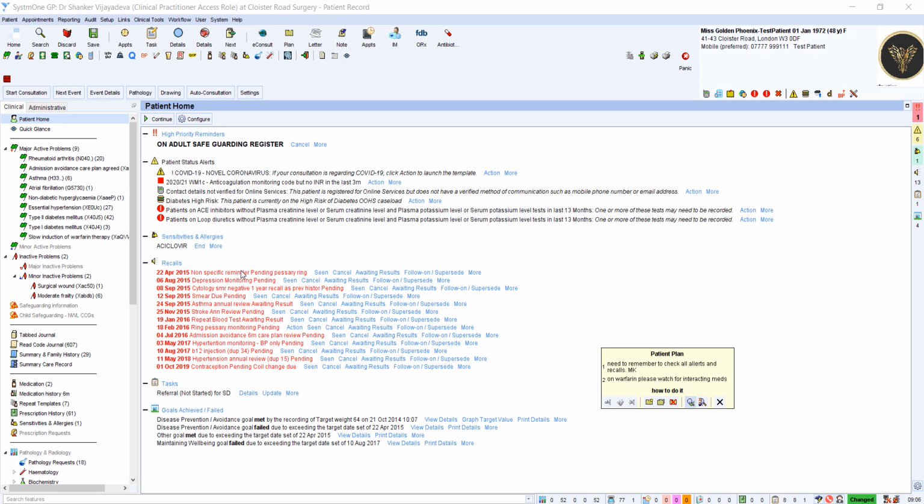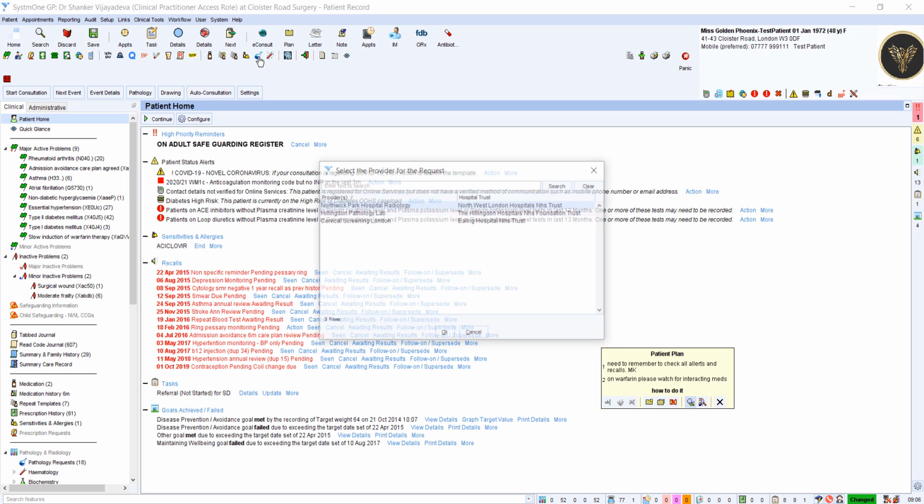Hi, this is a quick video to show you how you may use ICE, pathology requesting, to request a COVID test. So your toolbar here may look different for you, but if you look here, there's a blue bottle. So you click on that.